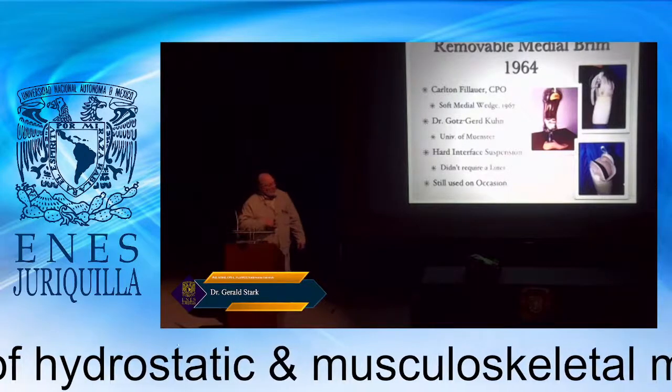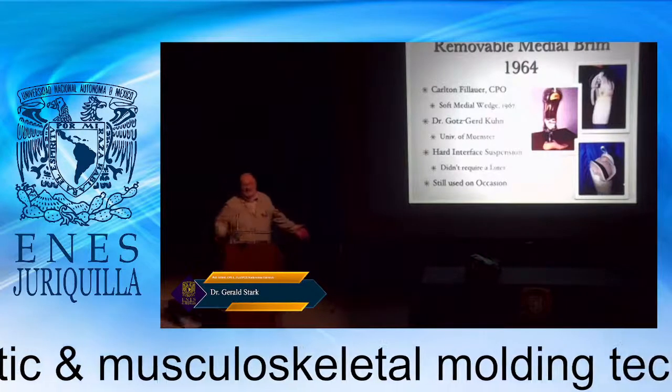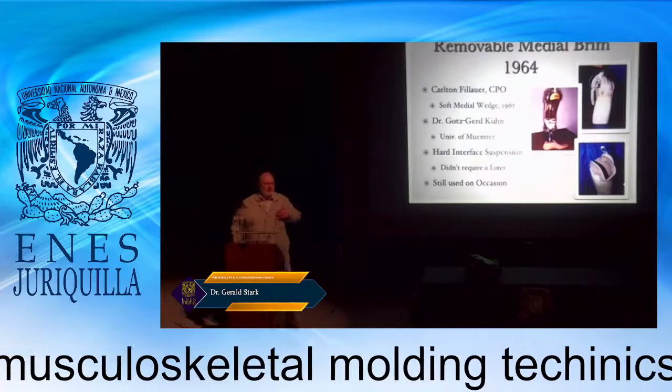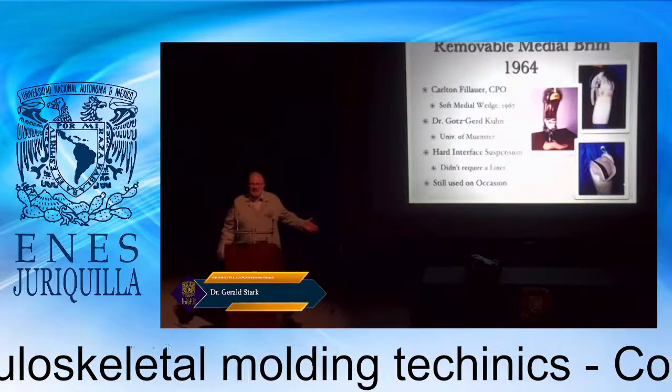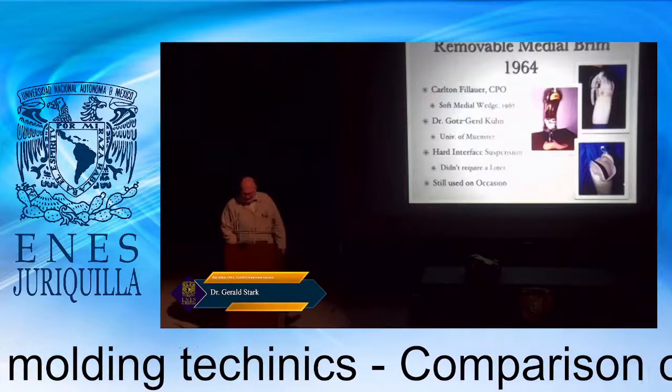Dr. Gerd Kuhn actually used this as well. And this is when you want to make a socket that doesn't have a liner. Now you may think, well, when would you never have a liner? Well, it might be someone who's a mechanic or a farmer that doesn't want a liner to get dirty.